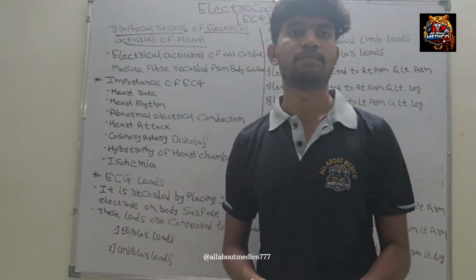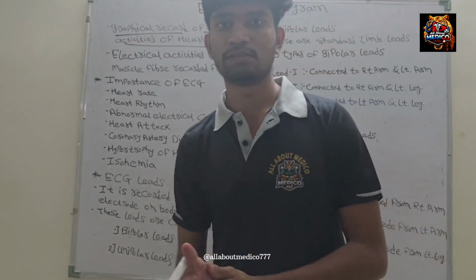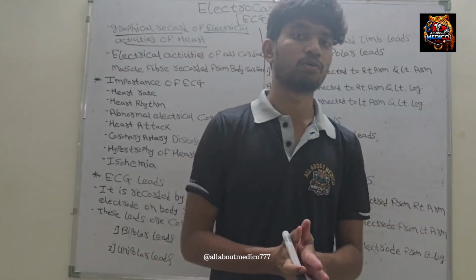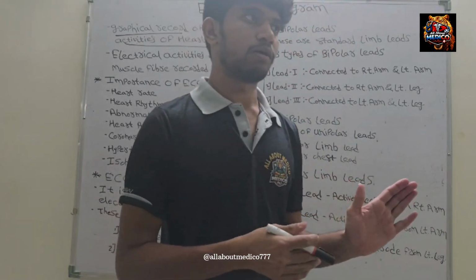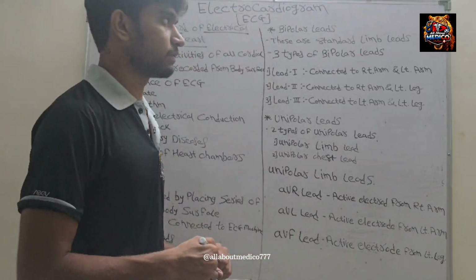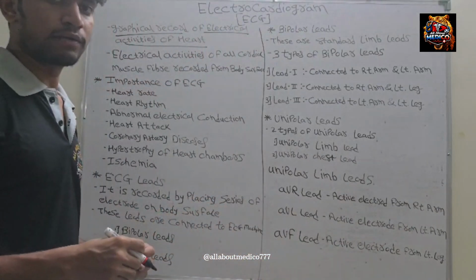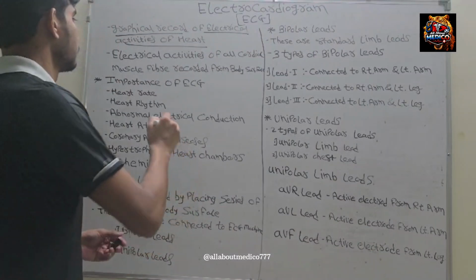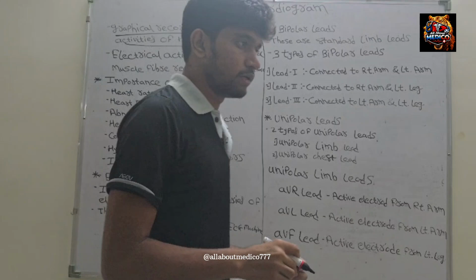Myself Kriya Sharir, today's student, and here we will discuss ECG. It means electrocardiogram. An electrocardiogram is a graphical record of electrical activities of the heart. Electrical activities of all cardiac muscle fibers are recorded from the body surface in ECG.